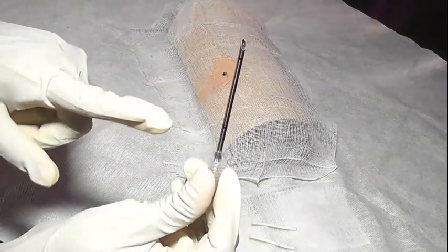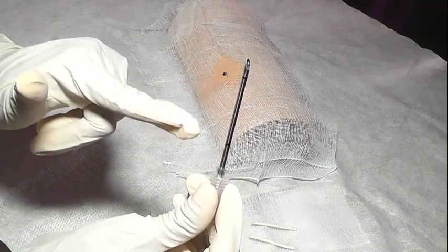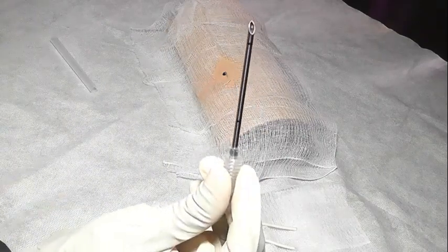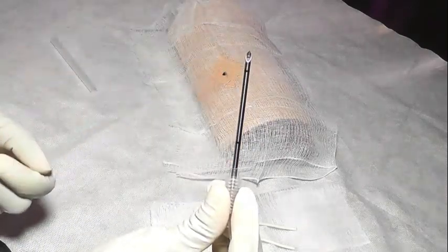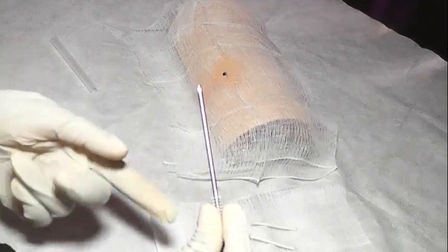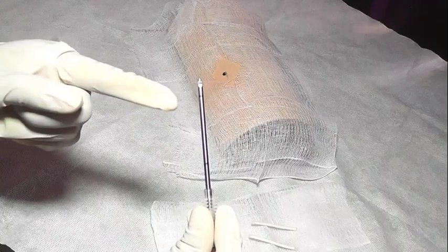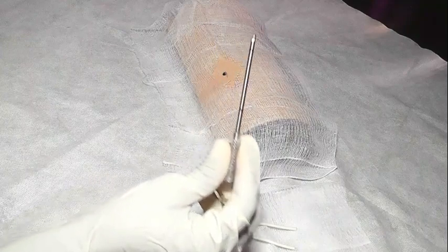Now the importance of these 2 marks is that when you are introducing, you introduce the trocar as far as this mark that is closer to the handle into the tissue. Then the mark at the tip: when you are removing, in order to change the direction for the second insertion of the second rod, you make sure you withdraw the trocar to the level of this mark that is at the tip. Alright, so we are going to see this one step by step.